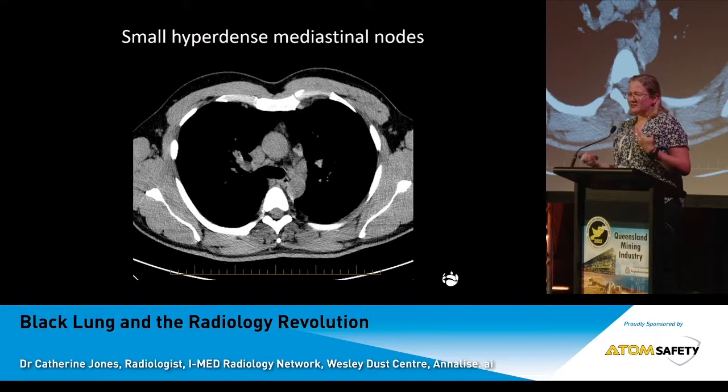We also see some other signs on CTs that don't relate necessarily to the lungs, but start to reflect absorption of the dust into the rest of the body through the lymphatics. And here's an example, again, I know difficult for non-radiologists to interpret, a really clear finding that to me, even if the lungs were pristine, this person is starting to absorb the dust into their lymphatic system.